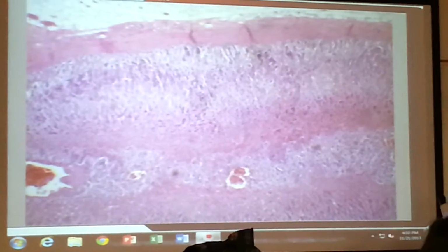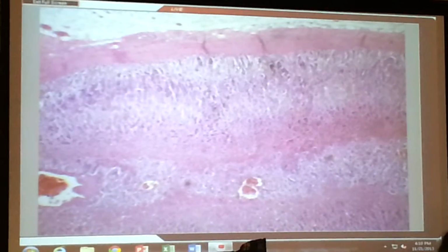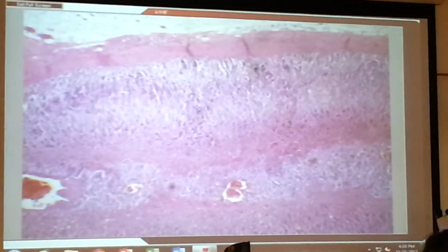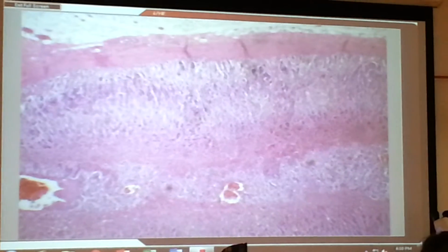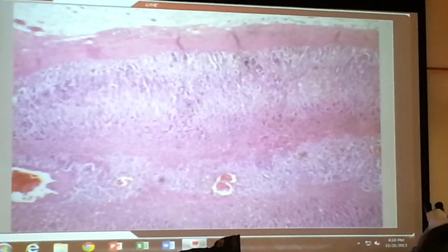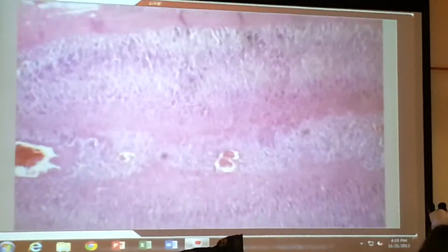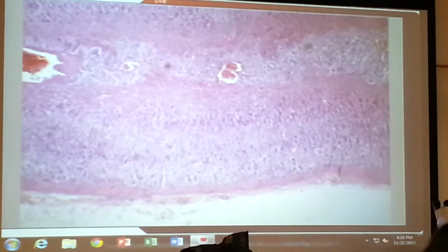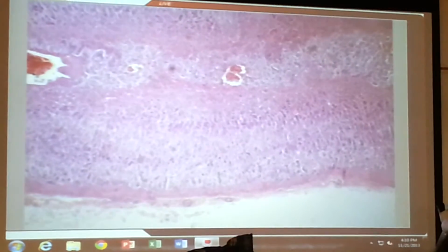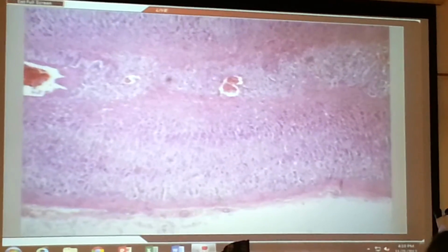But the adrenal cortex is going to be the outer layer. So it's actually from here to there. I'll tell you how I can tell that in a second. And adrenal medulla is the middle layer, and that's just right down here. So in other words, this is going to repeat. You're going to have cortex, medulla, and then cortex again. So if I scoot down this direction, that's still medulla there. This is adrenal cortex again. You see capsule again. So just pay attention to where you are.